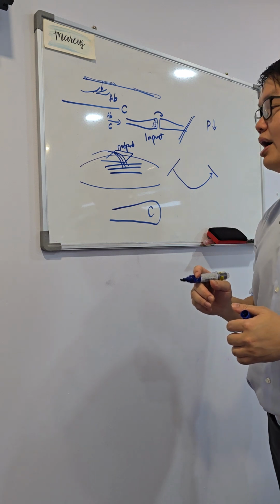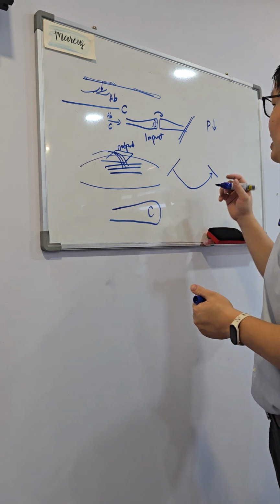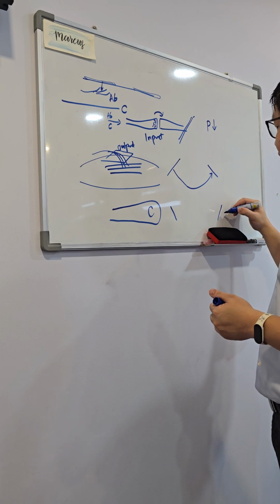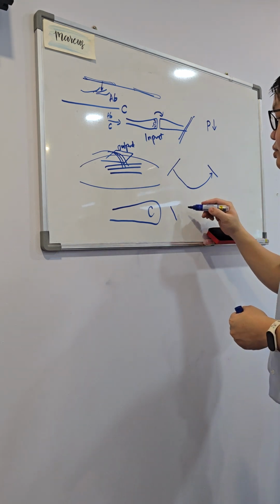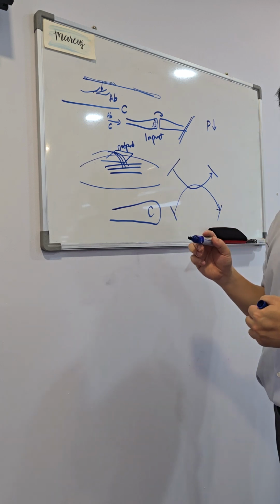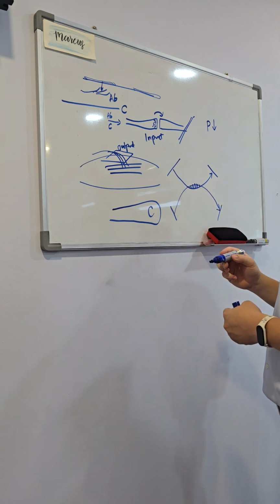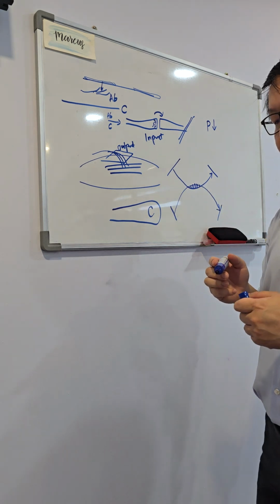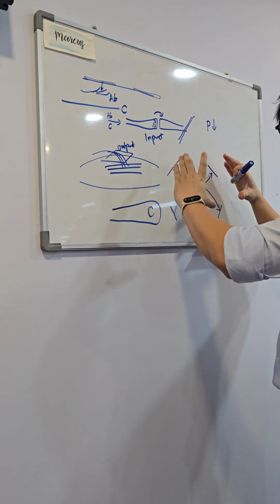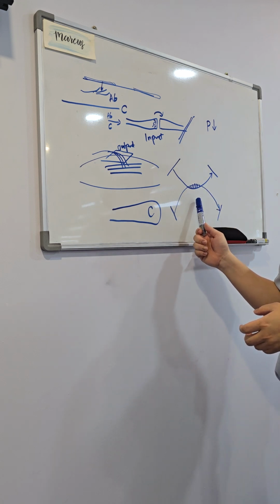Okay, but then what happens is the so-called interferential, by definition, is where I put another current and then another receiving plate, that would then create this part here. Okay, now the interference is this part here. All right, so the concept of it is we then allow the sort of focal point of these two areas to address very deep structures.